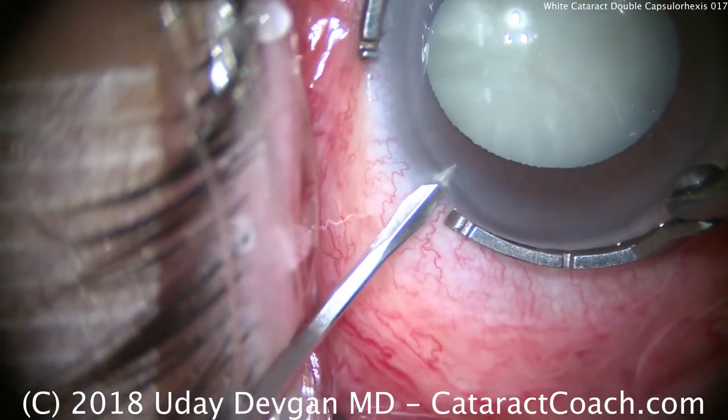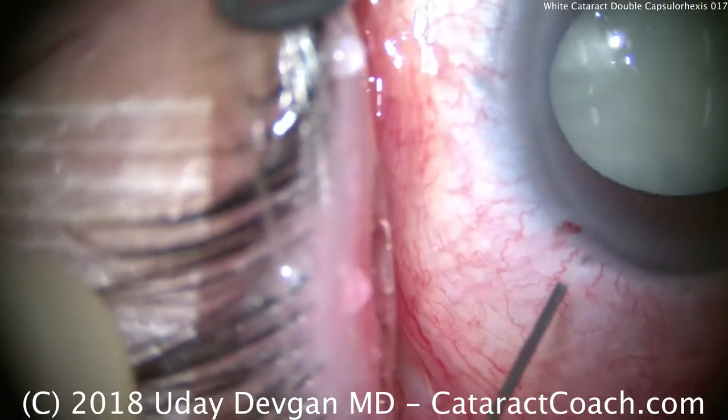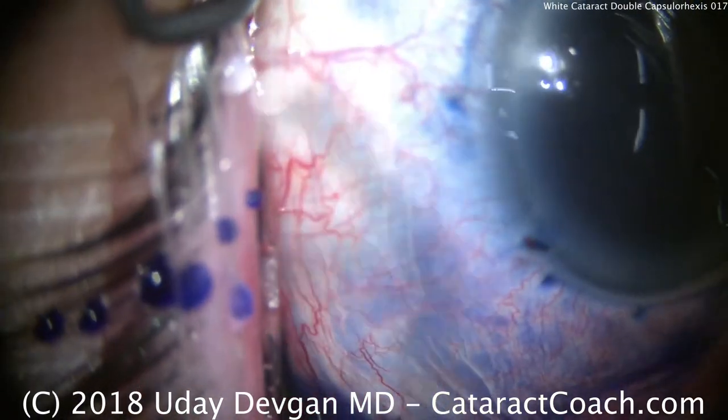CataractCoach.com with another white cataract. In this case, we're going to show you the double capsulorexis technique. Here's the TriPan Blue dye, and now we'll dilute it with some anesthetic, some lidocaine.